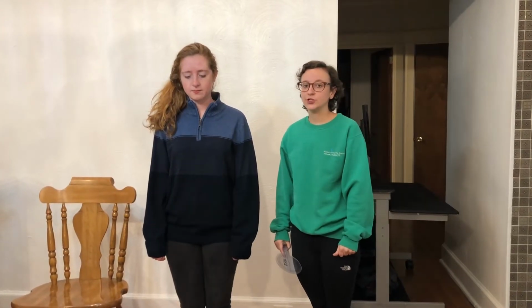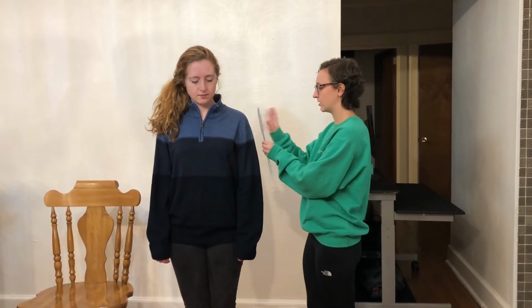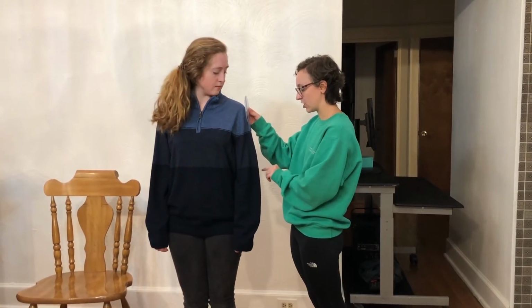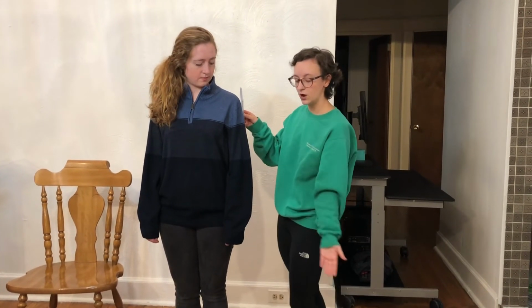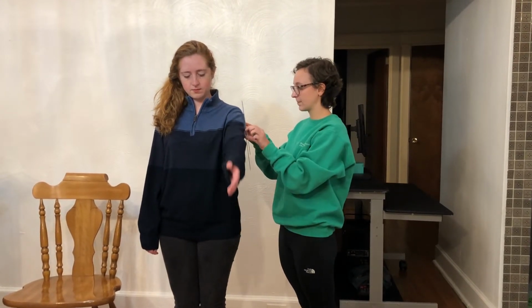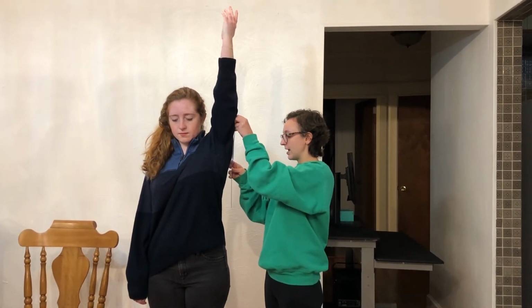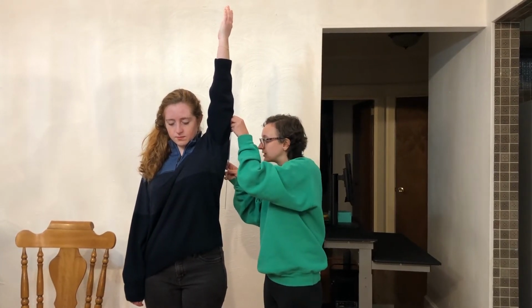Now I'm doing goniometry of the shoulder. So first we're going to do shoulder flexion. I'm going to put my fulcrum on the tip of her shoulder here, and I've got the stationary arm lined up with her body. So what I want you to do is bring your hand up in front of you and reach toward the sky. Go ahead. Okay, and my patient's reaching about 169.